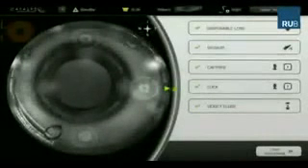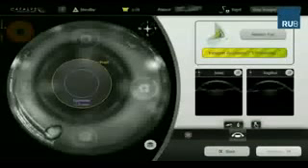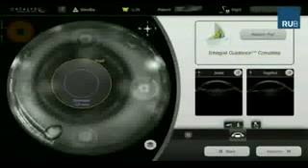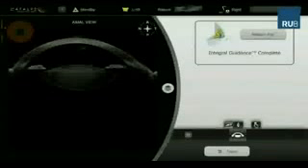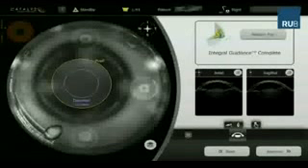After docking, a 3D spectral domain OCT automatically detects the ocular surfaces. The system suggests the capsulotomy, which was set preoperatively at a depth of 1000 micrometers and 4 microjoules of energy with a 3.5 millimeter diameter. The treatment time is 5.5 seconds.